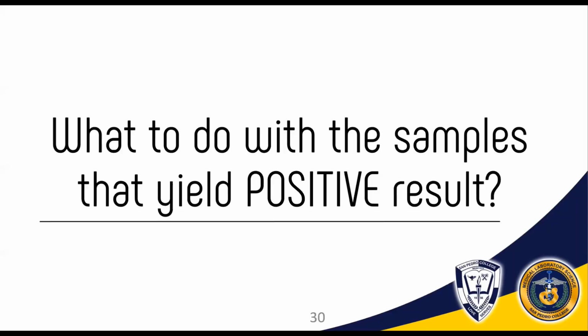So when we say ASO semi-quantitative tests, we determine the level of antistreptolysin O antibodies present in the patient sample. Semi lang siya class because this method is not direct measurement of the antibody, but rather approximation of the antibody concentration by means of computation. Okay? So here is another video of semi-quantitative ASO latex agglutination testing.